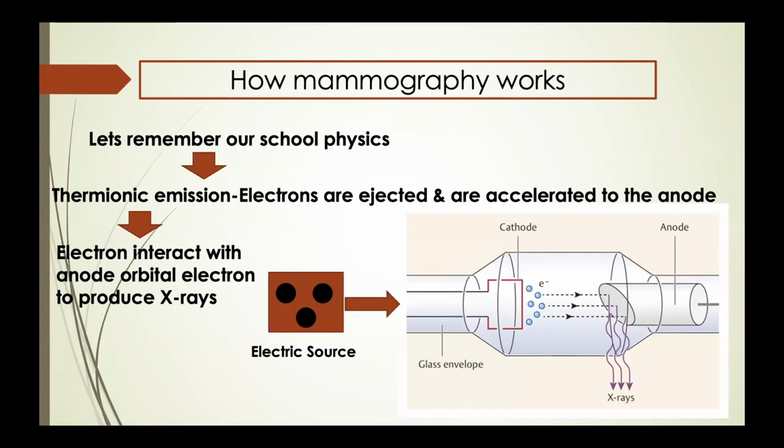When an electron is ejected from the K shell, for example, because of the structure of that atom and the rule that guides the orbiting of electrons, another electron from a higher energy level has to go and occupy that vacant position. In that process, it has to give off that change in energy, because they are arranged in order of energy level. It's coming from a different energy level to another energy level, so it has to emit that difference, that extra energy.